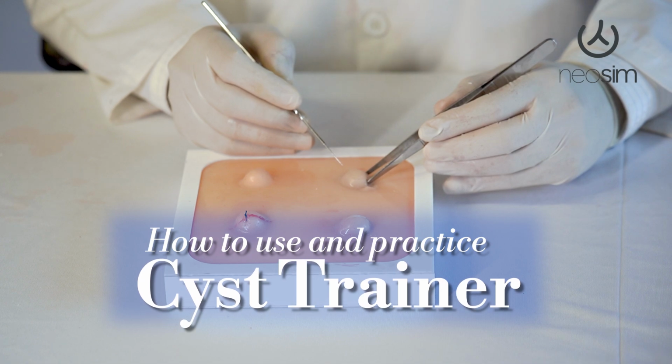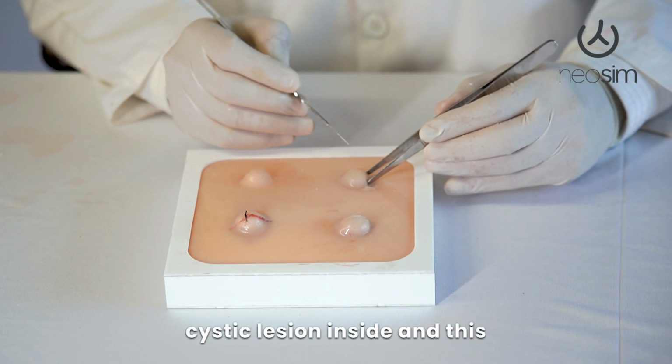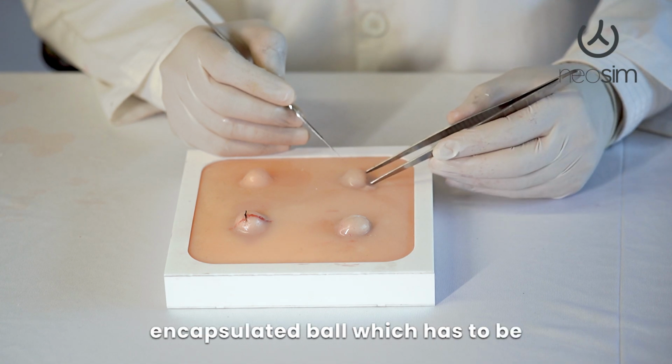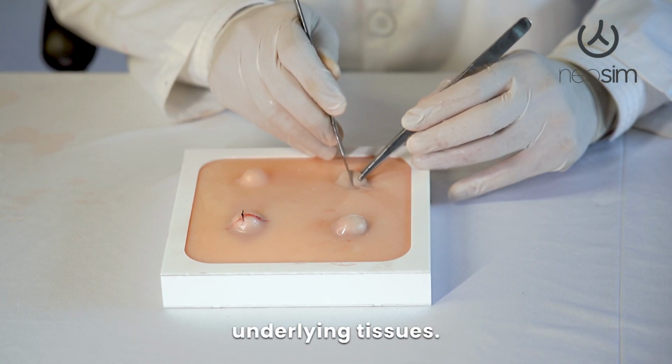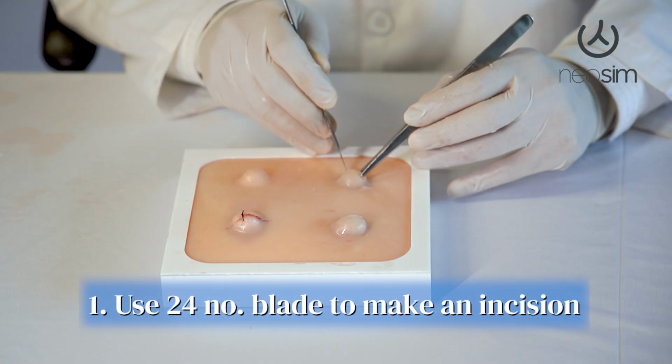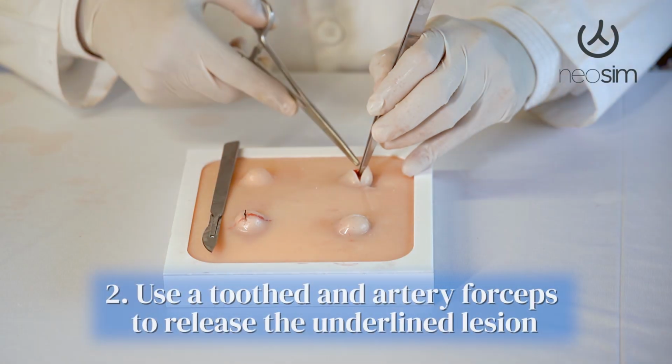Cyst removal is different from the abscess drainage since there is a cystic lesion inside, and this cystic lesion is like an encapsulated ball, which has to be removed by releasing it from the underlying tissues. We will make an incision on the superficial skin, and it has to be bluntly dissected.